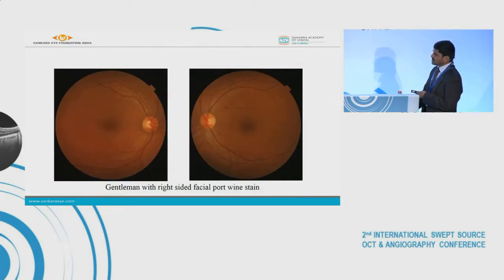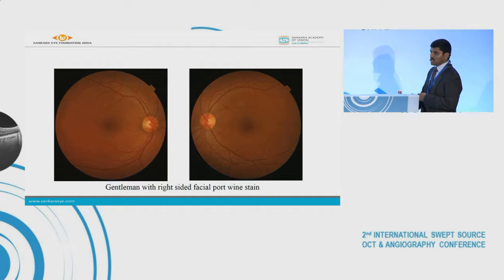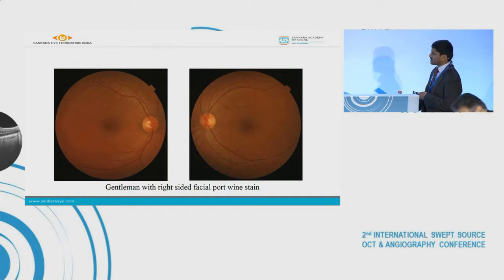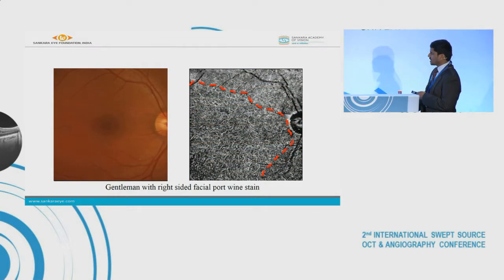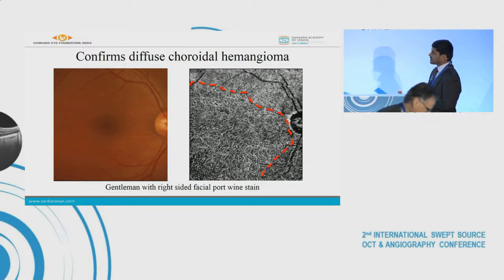This is a fundus photo of a gentleman with right-sided facial port-wine stain, so we need to exclude a diffuse choroidal hemangioma in the right eye. On fundus photo we can't see much difference between the two eyes other than a subtle orange hue in the right eye. But when we perform OCTA of the right eye, we can see multiple interconnected branching vessels in a spaghetti appearance, confirming the diagnosis of diffuse choroidal hemangioma.